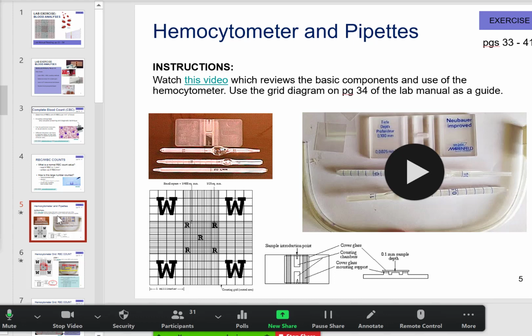Can you believe that? That was how they did it. So I come into the lab and the instructor is saying, yeah, that we mouth pipette. And I'm like, we don't mouth pipette in a lab, number 1. And number 2, we sure as hell don't mouth pipette somebody else's blood. Absolutely not. So we no longer let you mouth pipette. Yay. I do the dilutions for you.